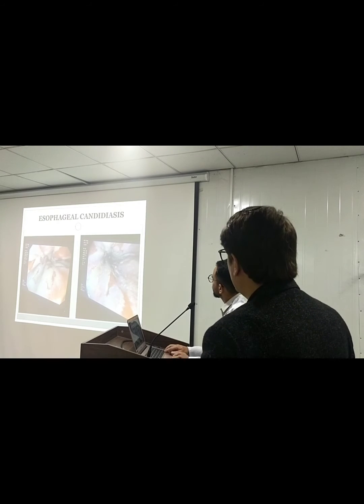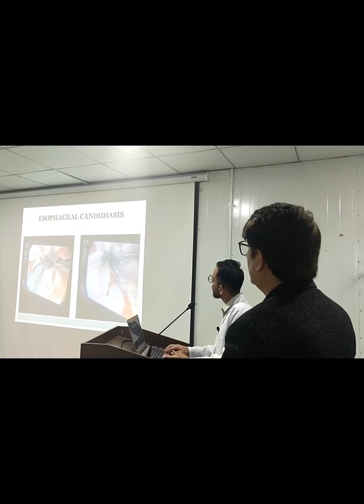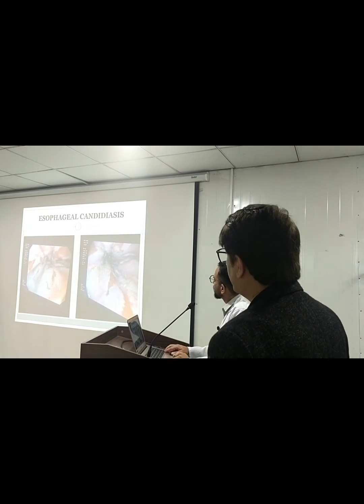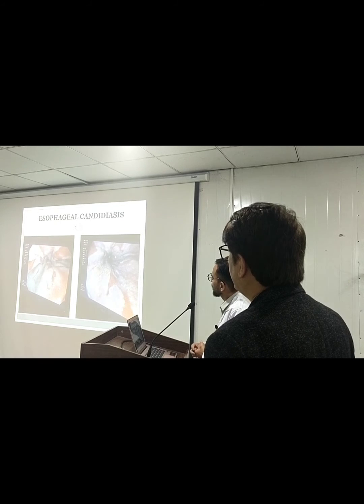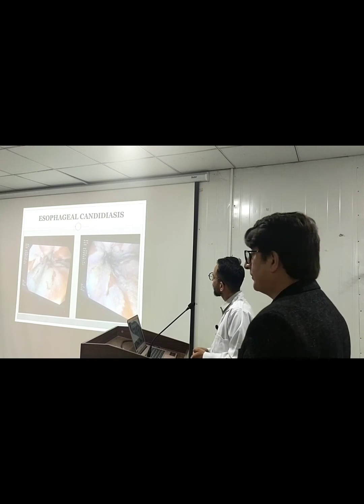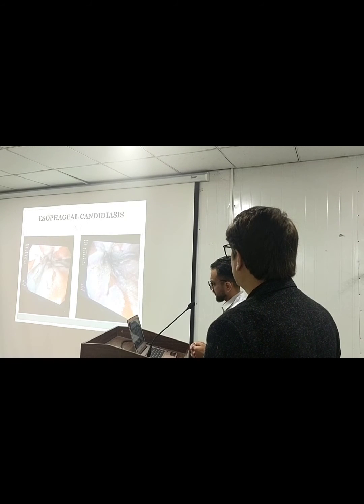Esophageal candidiasis. So this was a young guy who presented to us with dysphagia. Previously he was seen and treated in Karachi AKU. Later on he was referred here, and he presented with absolute dysphagia, and sometimes he was only taking liquids. So this picture showed the mid-esophageal candidiasis. I took the biopsies for the purpose of diagnosis, but unfortunately later on it turned out to be an HIV infection. So this was a young guy. Now he is under treatment of the infectious control specialist.